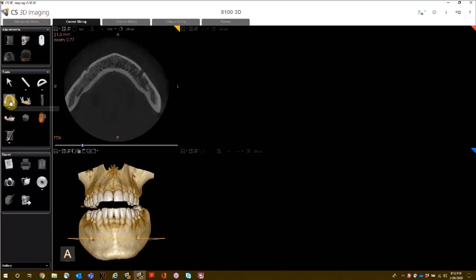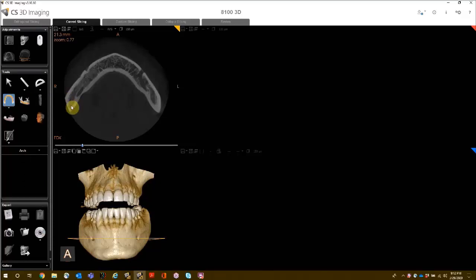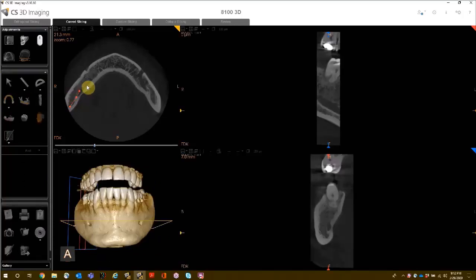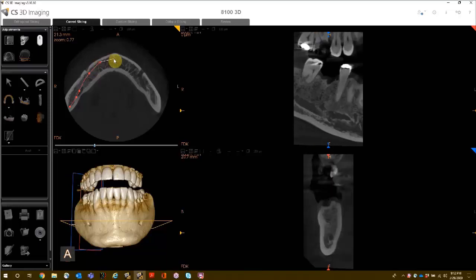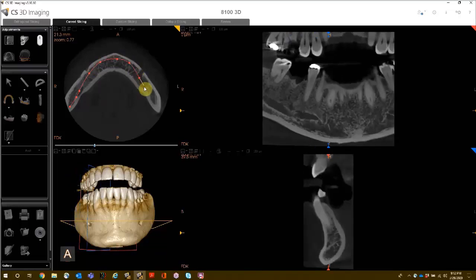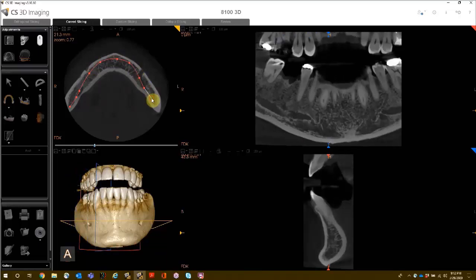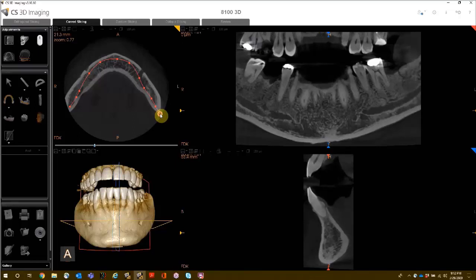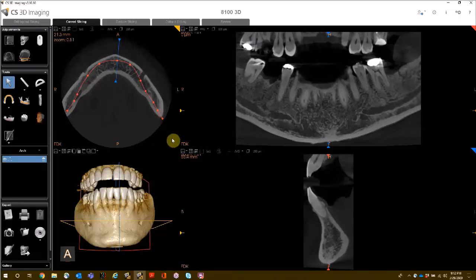Under your tools, activate Dental Arch Creation Mode. Single left-click all the way around the arch, then double left-click at the end. Once you have traced your arch, you will see the reconstructed panoramic in the upper right and the oblique coronal view screen in the lower right.